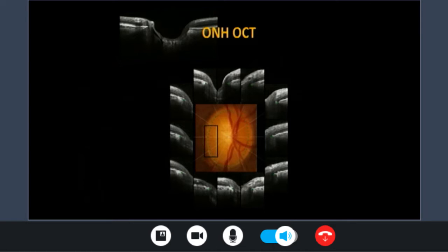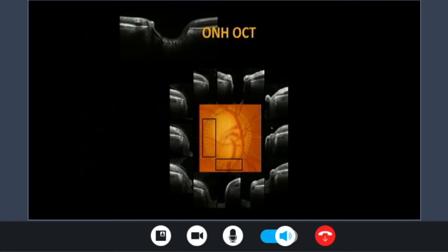This difference represents your overestimation of the residual rim, and that's very crucial for us in glaucoma. So it means that sometimes, on certain occasions, we are overestimating our residual rim. And that's something very important for us in our clinical practice. I'll skip this example.